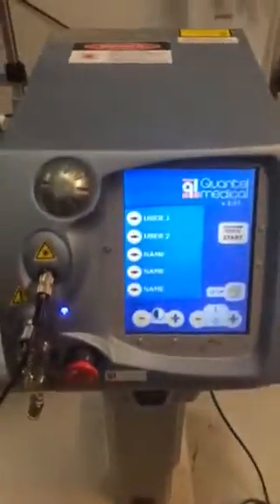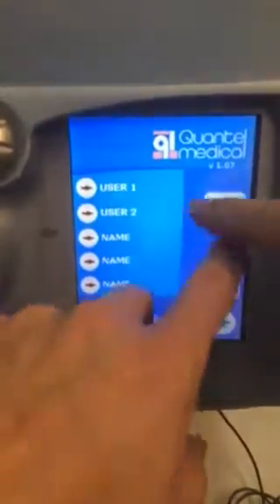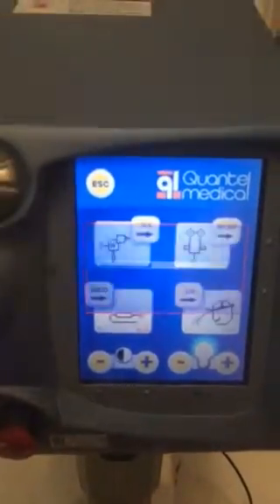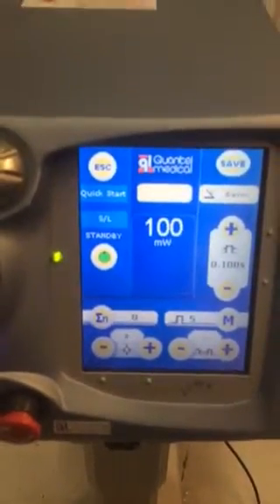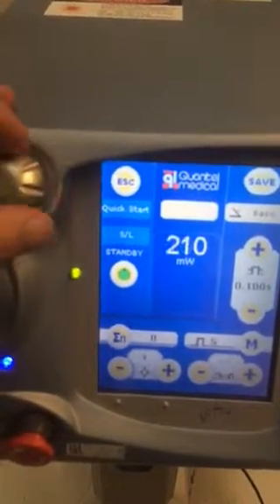Here's a video of your laser. You can set user preferences over here. You can attach different things — LIOs — if you want to get an LIO, set it up right there.